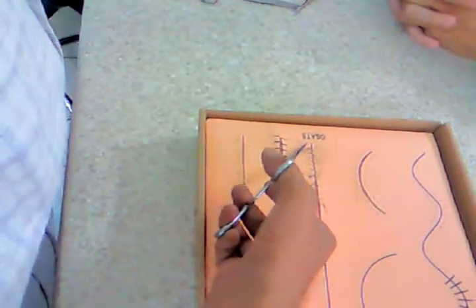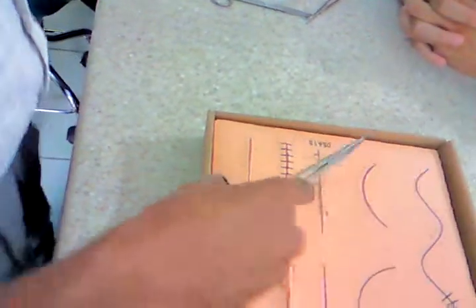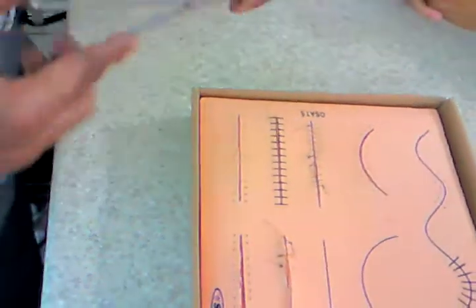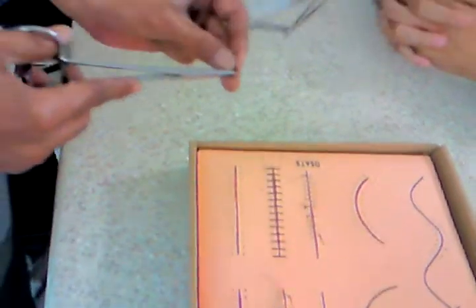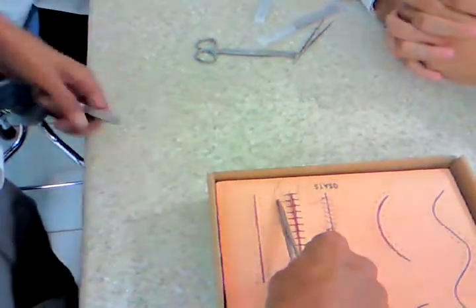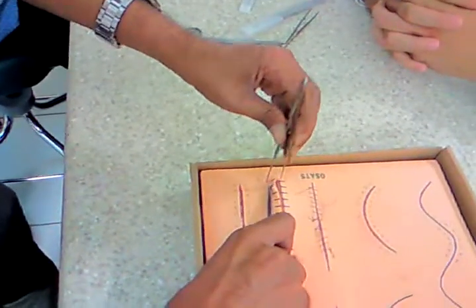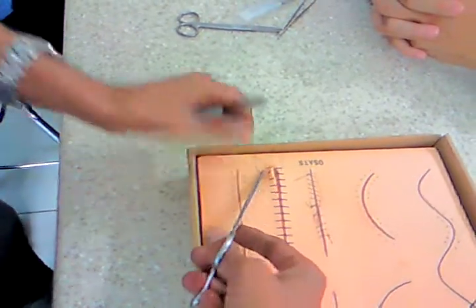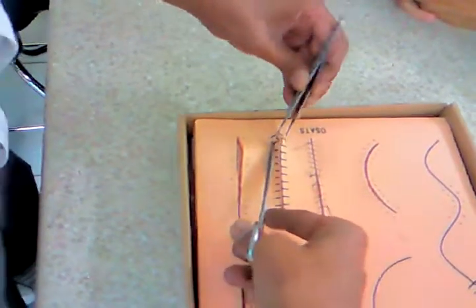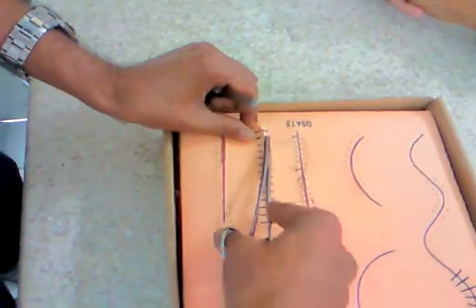Okay. Now watch. We didn't do anything. We have not tied any knots, nothing. In the previous one, what we did was we took a closed dermo-epidermal junction at the same level. Now we are going to go a little opposite. I'm going to again reverse my needle direction. On the same side, I come to this and I take a bite here. Full thickness as usual. And on the opposite side again, full thickness till the tip comes out. Now watch how the suture will look.